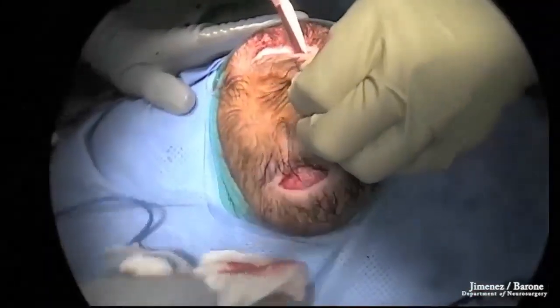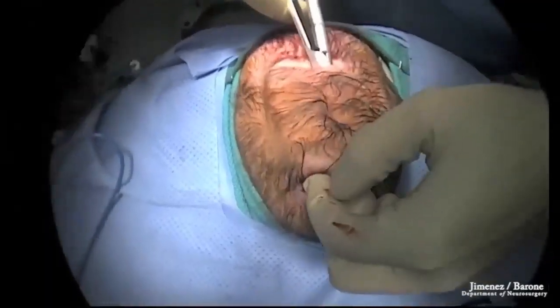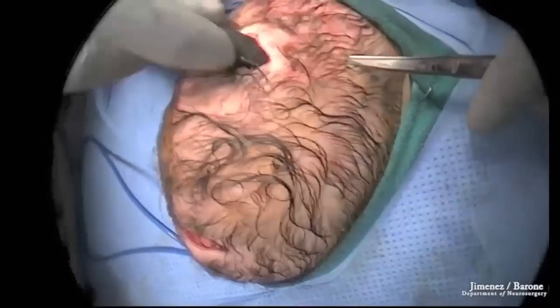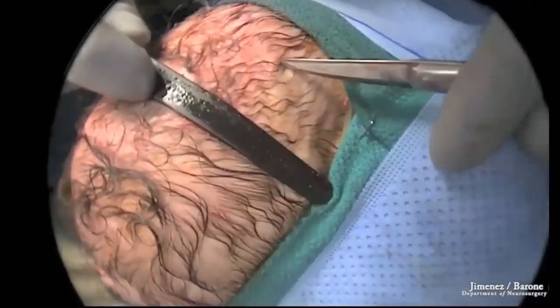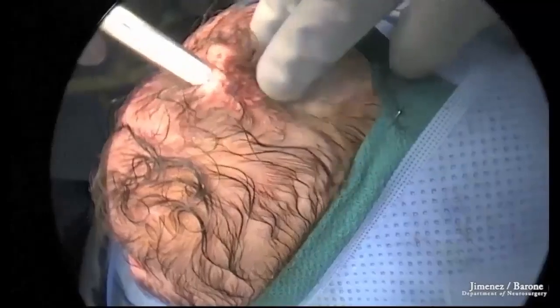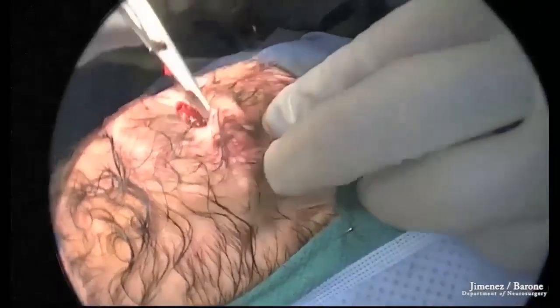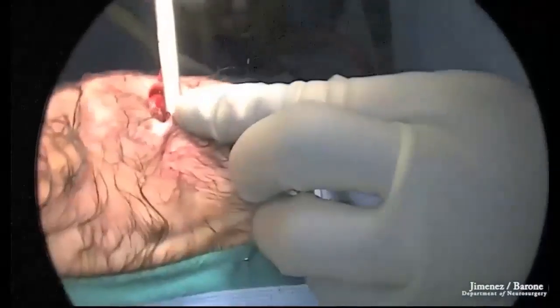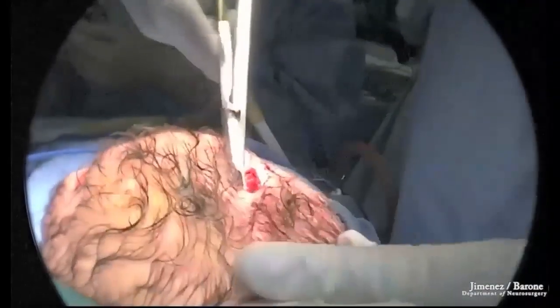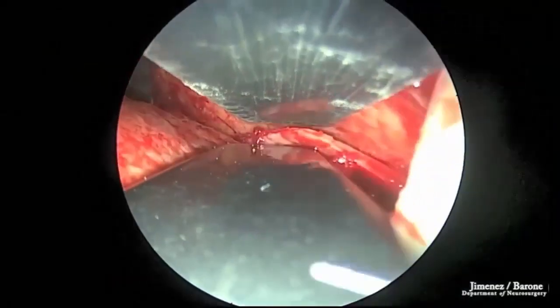Paramedian osteotomies are then created with either sharp Mayo scissors or bone cutting scissors. These are done on either side of the midline. Wedge osteotomies are made then after the bone has been removed. Brain ribbon is used to free the dura all the way down to the squamosal suture, and the scissors themselves are used to free the epidural plane or the plane below the galea. Scissors are then used to cut the wedge anteriorly, posteriorly. This is done in all four corners.